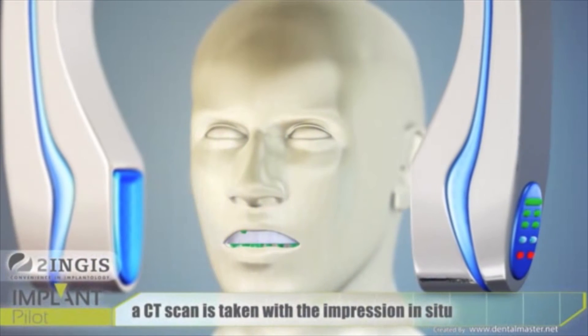Normally with a medium-experienced dentist, the patient comes in, needs anesthesia, needs to have the gum cut open with a scalpel, then the implant is placed, then sutured — it takes almost an hour. Now with flapless surgery, the patient comes in and comes out in just 15 minutes, so you gain 45 minutes.